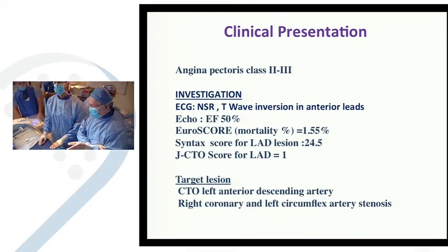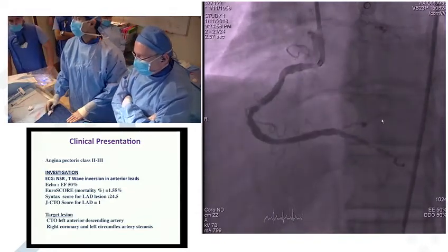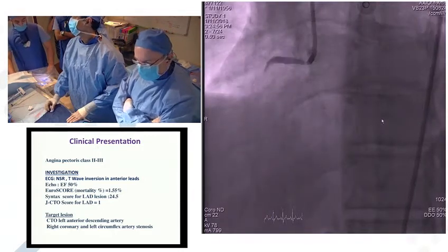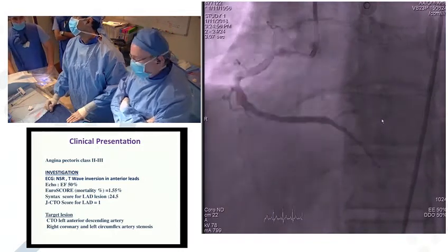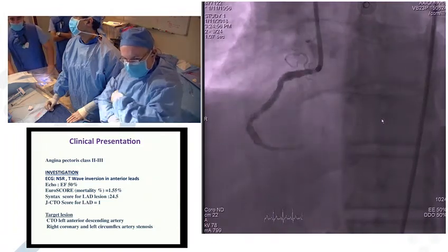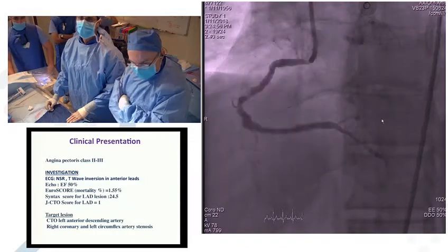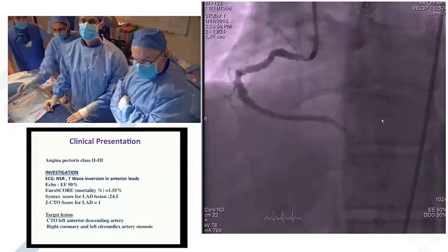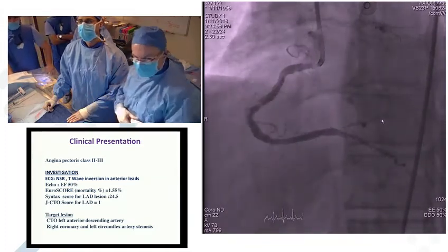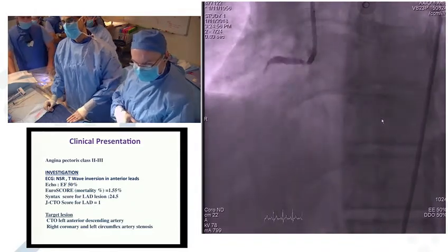So can you show the angio? Yeah, this is it. So you see this is the first shot. We didn't inject into the left main and did a dual injection, but you see there is a conus branch going to the LAD. So you see the LAD, and because there was the likelihood, because of the length of the lesion, that we have to go retrograde, we had to fix the right also for contralateral injections.